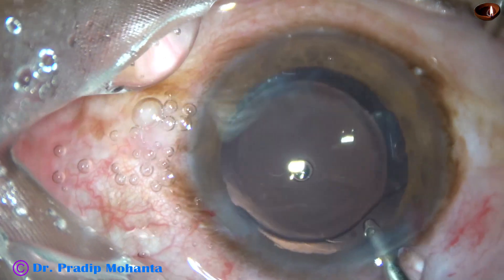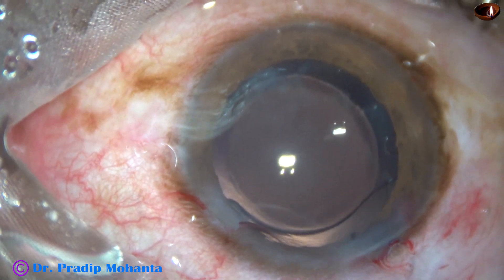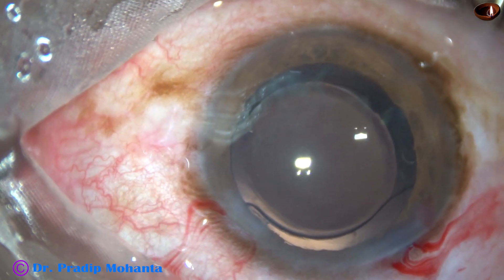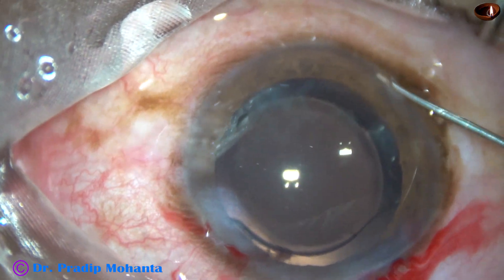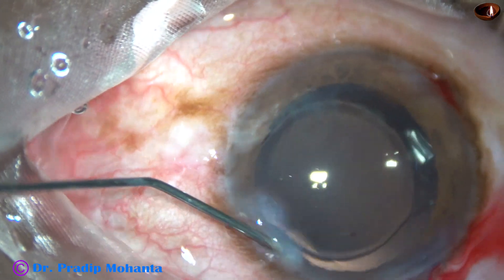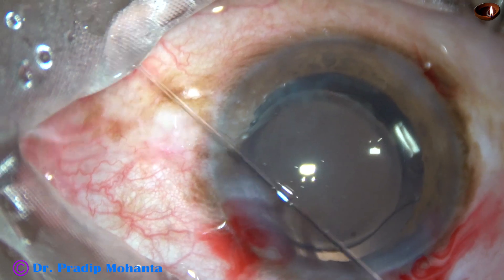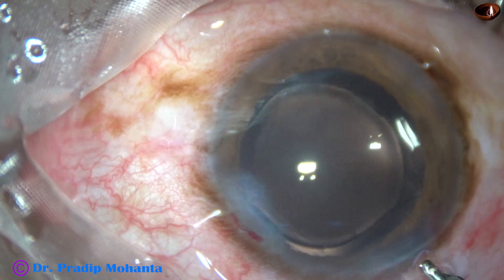The case is essentially done. We just have to close the side ports. The corneal stroma on either side of these stab incisions is hydrated with BSS, and the side ports close and stop leaking.